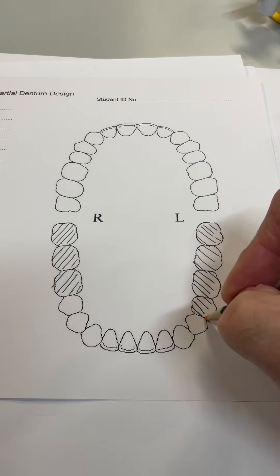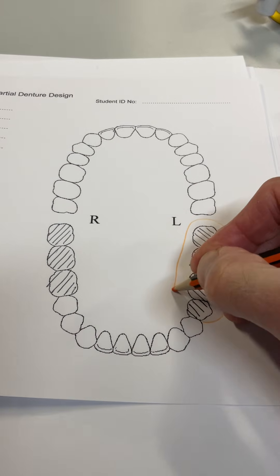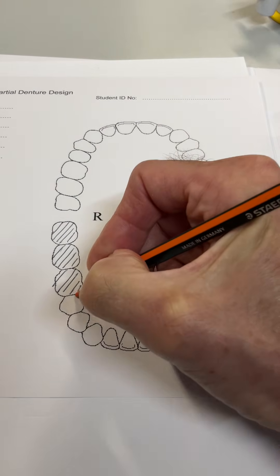We're now going to draw in the saddle. Make the saddle nice and big, nice and obvious. Lingually it's all acrylic — same on this side.